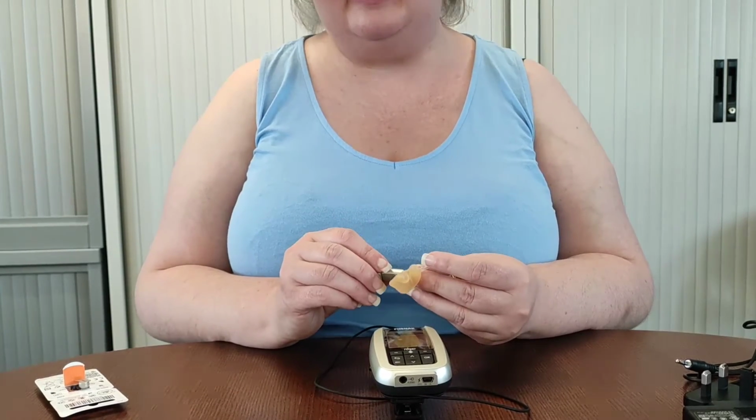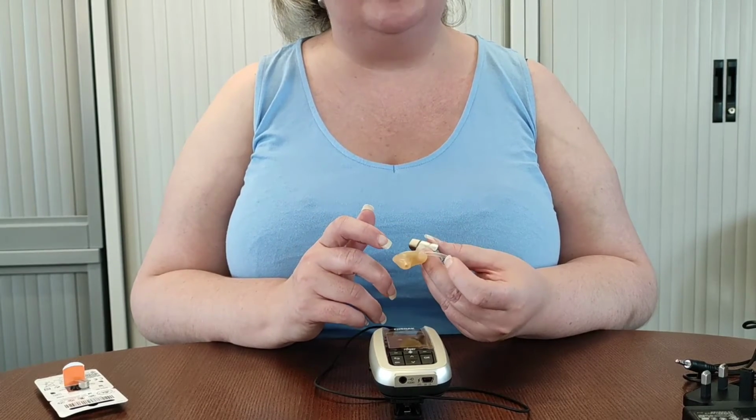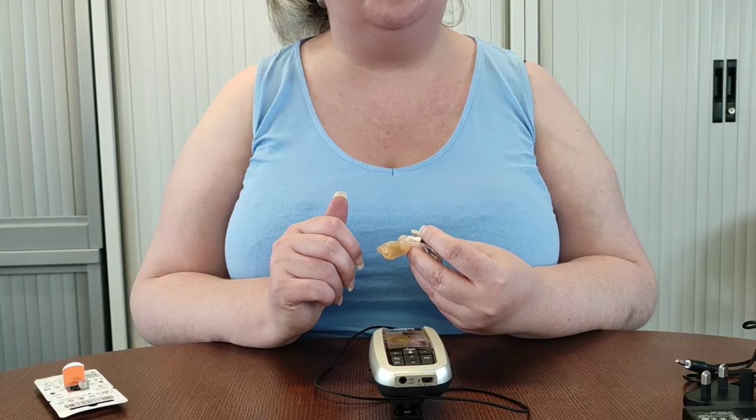If it doesn't connect still, this would be the point where you would contact the Newham Sensory Service. So you can contact your qualified teacher of the deaf, and either they will organise a visit as soon as possible or request that the technician for the service will come and do so.